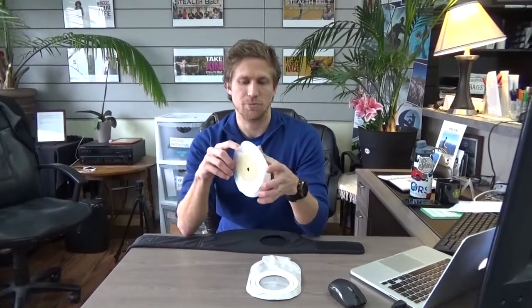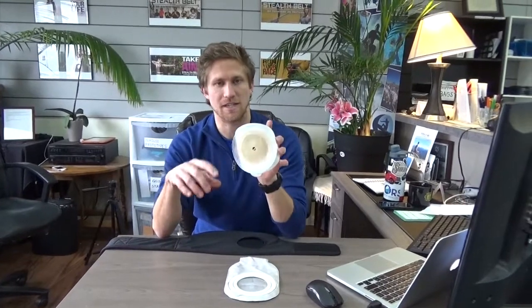Hi, I'm here today with Stealth Belt and I'm going to be talking about one of the appliances that is commonly used — the Sensura Mio two-piece adhesive appliance, as seen here.